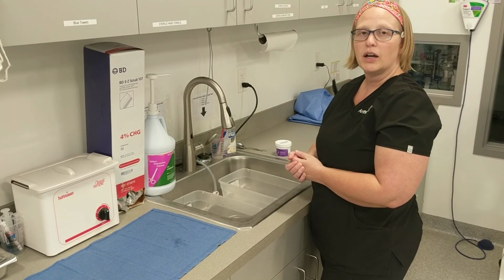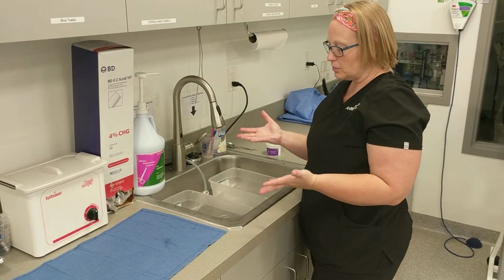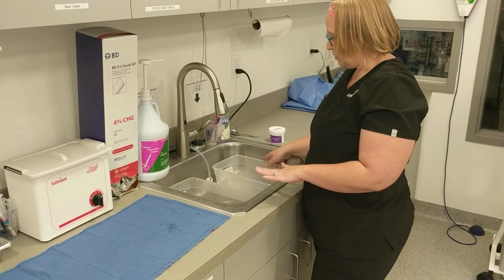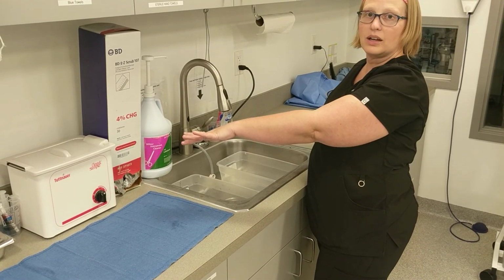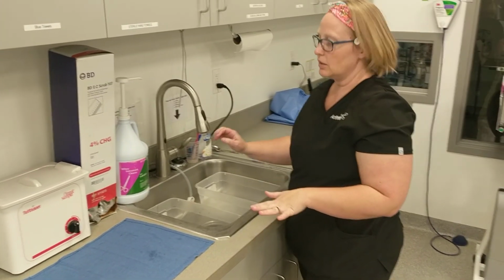We're going to go over cleaning surgical instruments after surgery. The first thing I'm going to do is I have some dirty instruments in the bucket here. I've got a secondary bucket because I have some that just finished up in the ultrasonic cleaner. I'm going to talk a little bit about cleaners first.